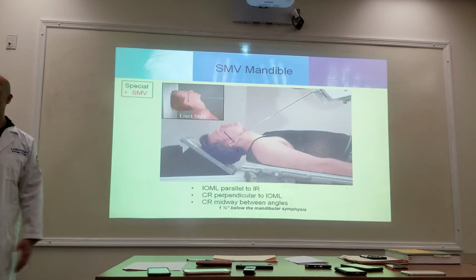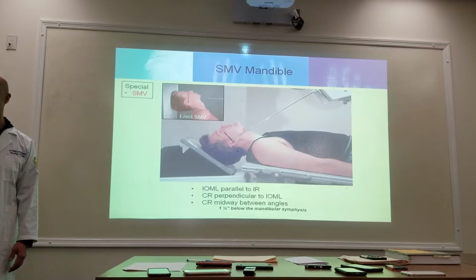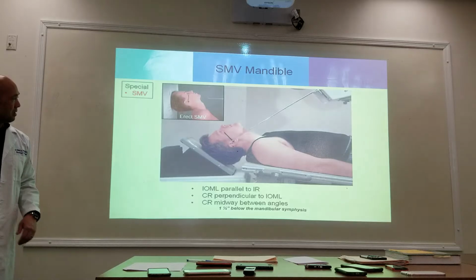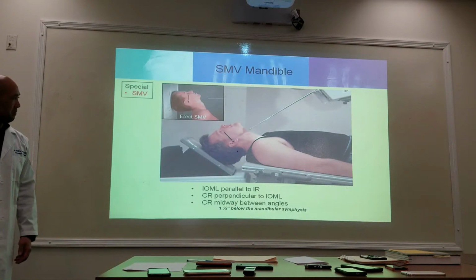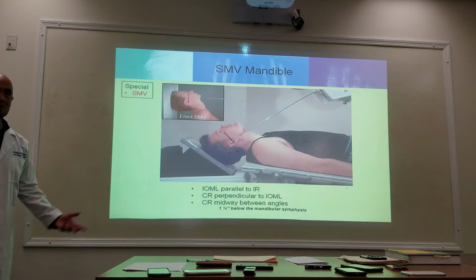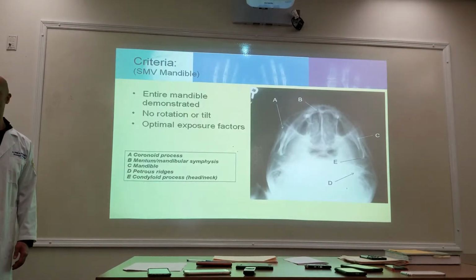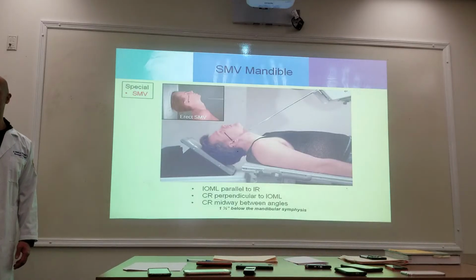SMV, okay, same thing. This was the same thing as the cheekbones, zygoma, top of the head flush with the image receptor, and we're going to center 1.5 inches below the mandibular symphysis. That was the same thing as the cheekbones, wasn't it? Okay, same thing.